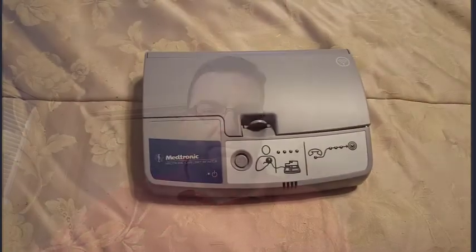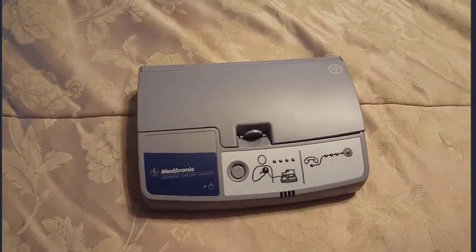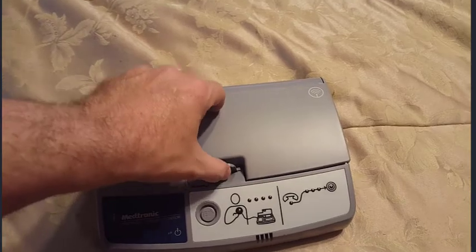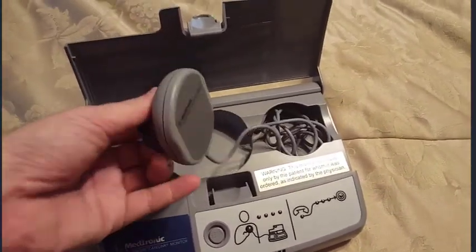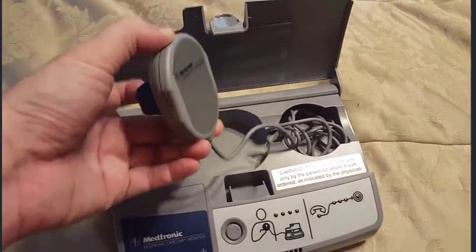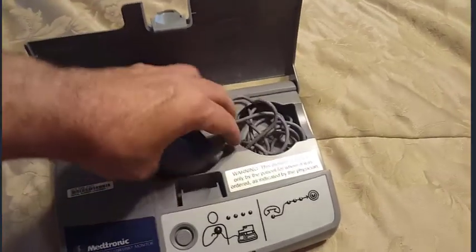Alright, I'm now back at home, and the last thing I wanted to show you in this video is how my new ICD was going to be monitored by my doctor. With my old device, I would send regular EKGs over the phone to my doctor in his office with this device. This is from Medtronic. What you would do is take this part of it, put it over the device, and it would collect data and send it wirelessly through my Wi-Fi connection to my doctor's office.